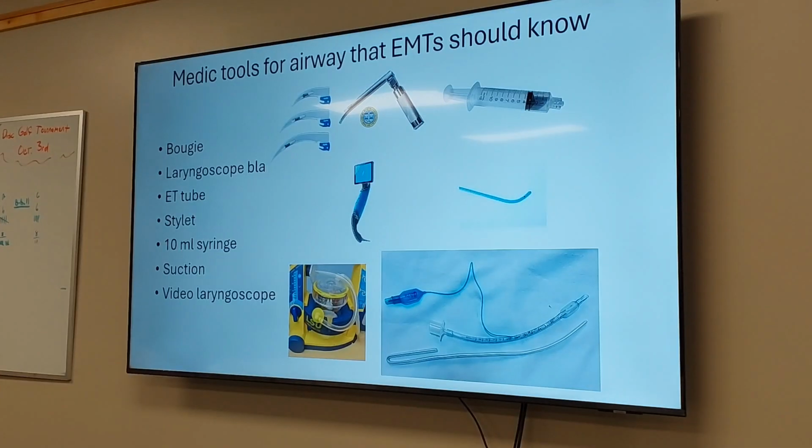I talked a little bit about some of the tools that paramedics use because a couple of you work with medics, so I figured I'd bring it up. So a bougie is the middle row all the way to the right. It's an intubation tool, helps get a difficult airway. Some people use them every time. Some people only use them if the airway is going to be difficult.